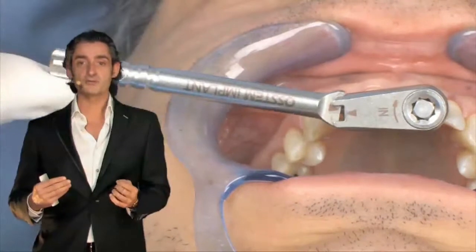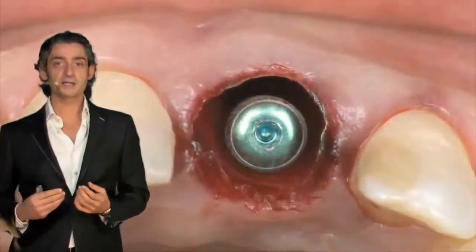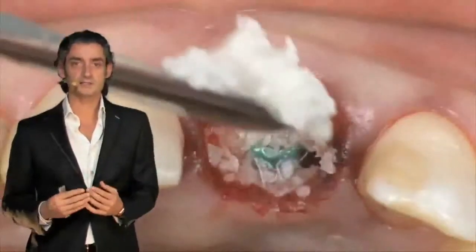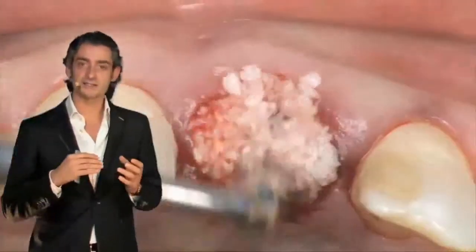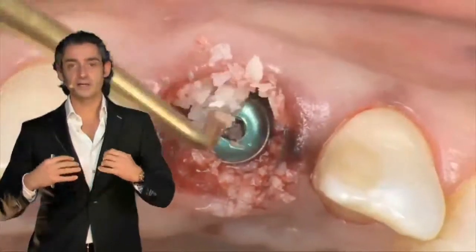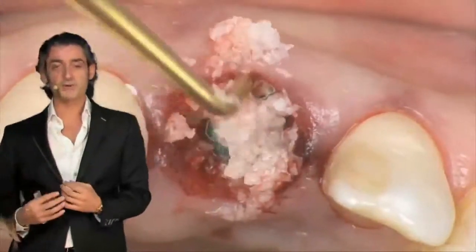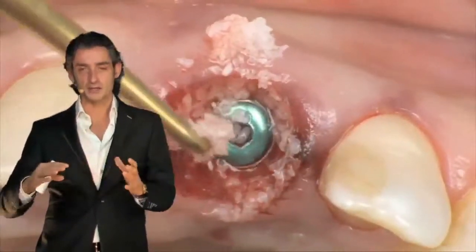Right now we have to check the stability. As you can see here, we were over 35 Newton, and right now we have to use this bovine bone just to fill the jumping distance. So this for me was a really nice case to do, precise. I try to compact this bone substitute inside the gap just to avoid any kind of contraction of the volume, especially on the buccal side. With a fine instrument, I compact, avoiding contact with the surface of the implant, and I try to do everything in a gentle way.